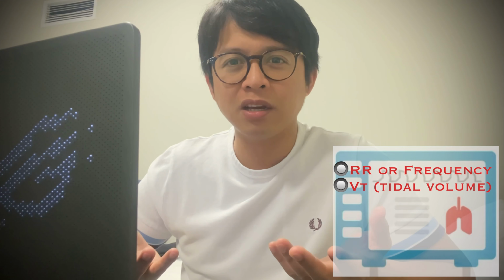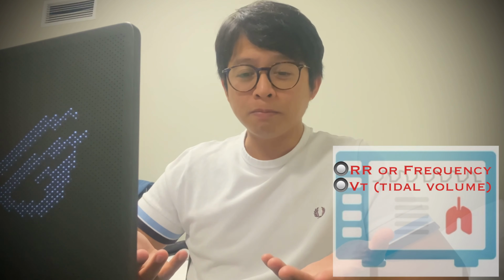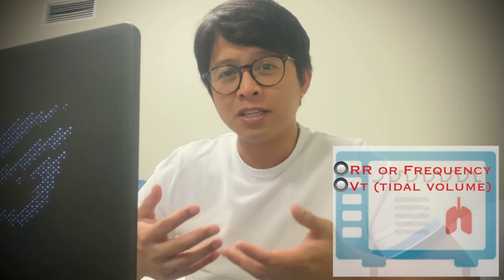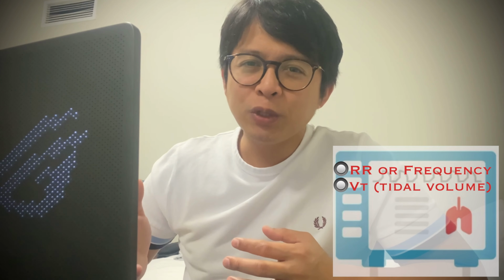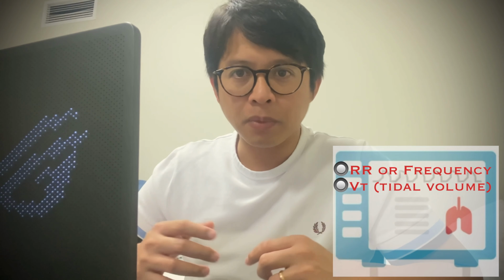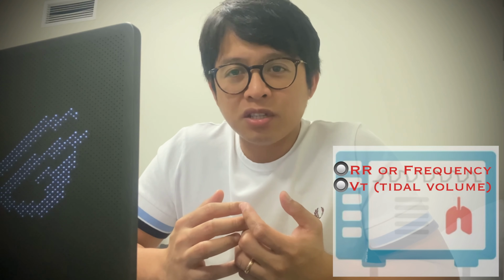Sometimes we take a deep breath, so that's a high amount of tidal volume. And then sometimes we take a small breath, so we have a small amount of tidal volume. Tidal volume pertains to a certain amount of gas per breath. When you ask what that tidal volume gas is about, well, it's a mixture of gases and oxygen.